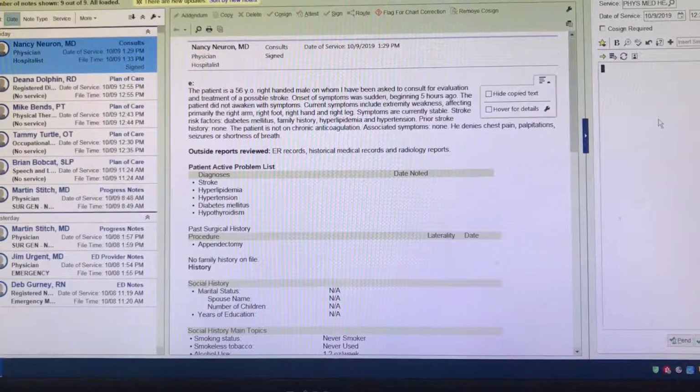If the patient is not having any symptoms at all, no shortness of breath, no chest pain, we will continue to monitor the patient. If they're having chest pain, lightheadedness, dizziness, shortness of breath, any symptoms at all, we need to consider calling an ERT. That is your intervention for that patient.